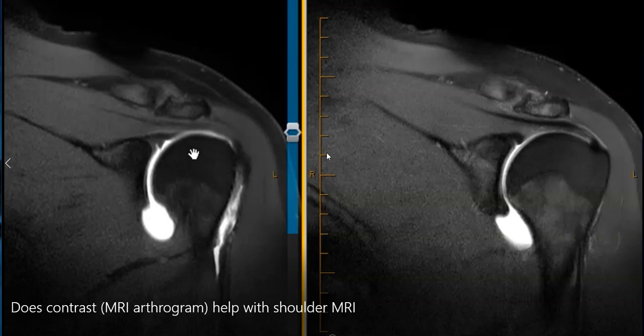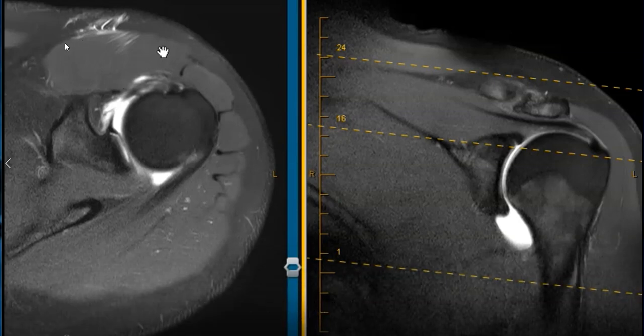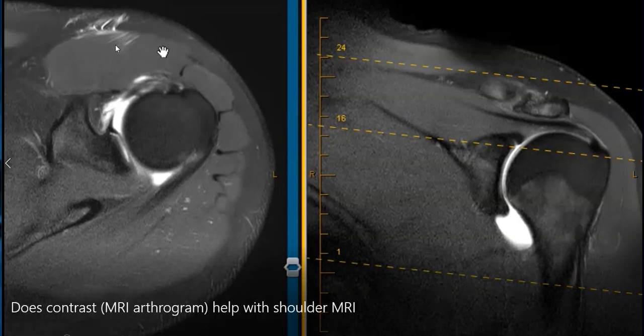Again, this is a case of contrast in the shoulder joint — an MRI arthrogram. In this view you can see how we perform the arthrogram. This is lidocaine in the front of the shoulder joint. The patient is laying on their back; here's the back, this is the round humeral head, and here's where we inject the contrast. We numb the skin up here, put a needle down through the deltoid muscle — this patient has a nice big anterior component of the deltoid — and it goes into the joint here, filling it up with the fluid.